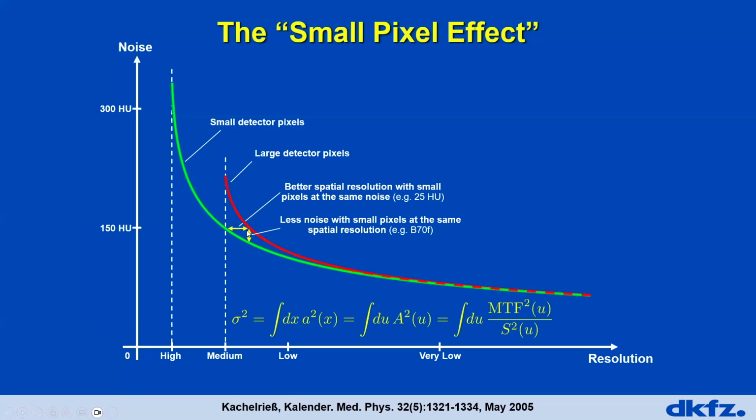However, of course, you could also invest that in an increase in spatial resolution at the same image noise. This is also possible, and I will give you a couple of examples in a second.